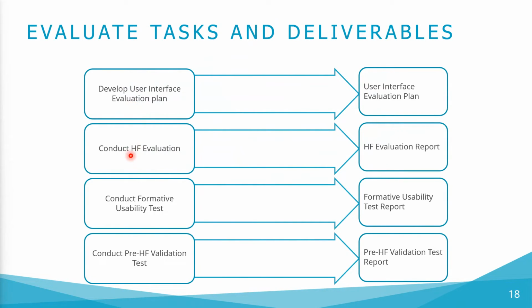Conduct HF evaluation. As part of the above task, we might elect to conduct an HF evaluation of the product. This activity can also be called an expert review or design critique. During this step, one or more HFE experts analyze the product and identify the product's strengths and opportunities for improvement. This step will produce design recommendations, for example, suggested mitigations to address any weaknesses, which we can use as an input to the next iteration of the product's design.